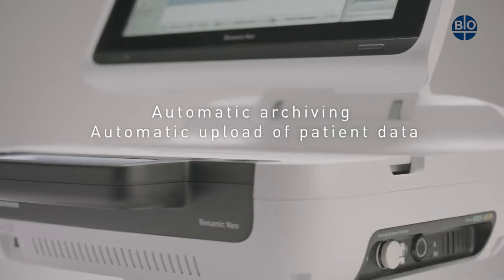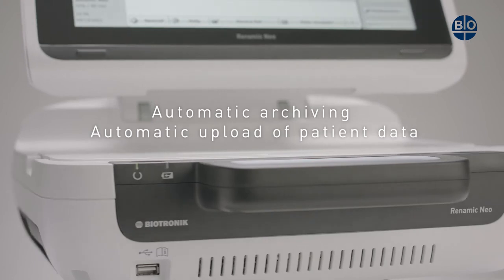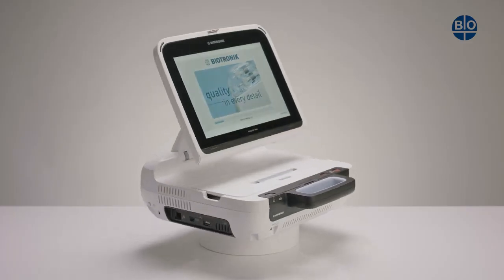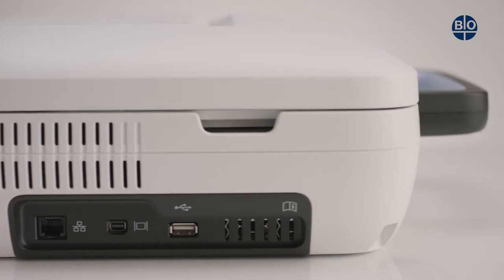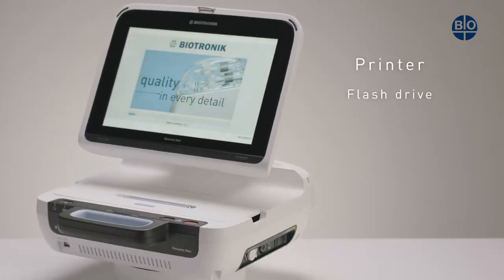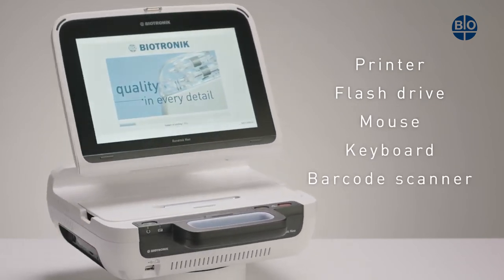The RENOMIC NEO is a programming device which is able to automatically archive and digitally upload patient data — no more printing out and paper filing. USB interfaces can be found on the front and left-hand side of the device. This allows the RENOMIC NEO to be connected to a printer, USB flash drive, USB mouse, USB keyboard, or USB barcode scanner.